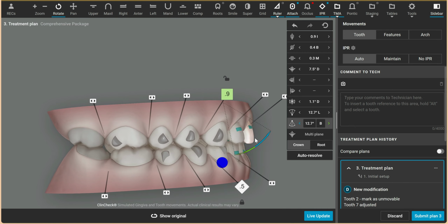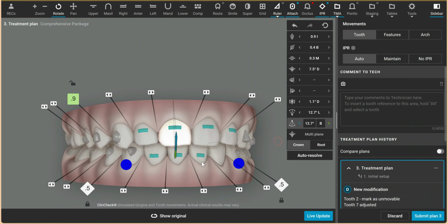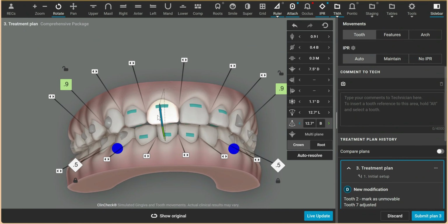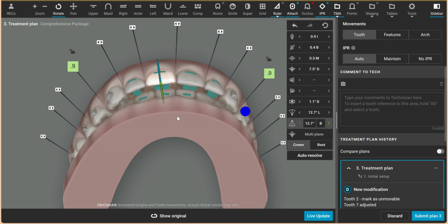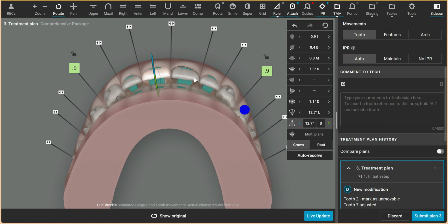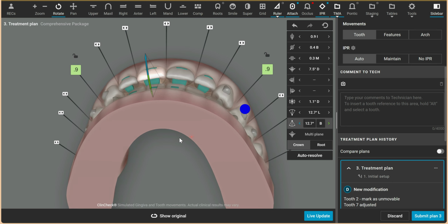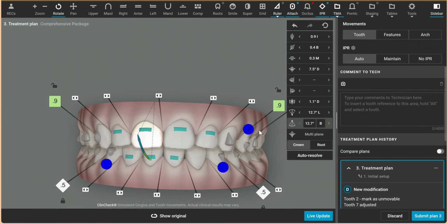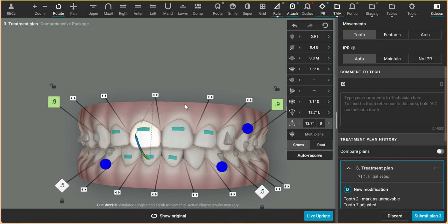So you can improve that lingual inclination and create some bite relief by using, in addition to the torque, there's torque in those teeth. That's why there are power ridges. You could even use some labial crown tip. There it is right there. Buccal, lingual crown tip. You can see that there's a B for buccal crown tip. So I just wanted to point out that these cases can be tricky.